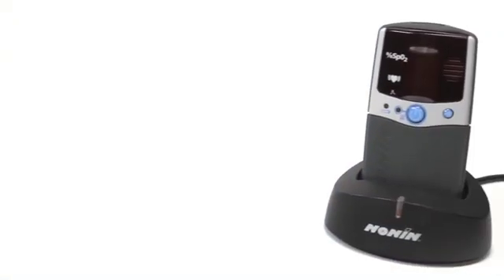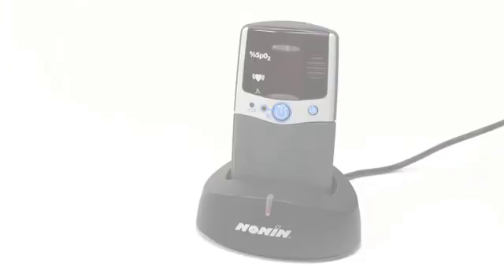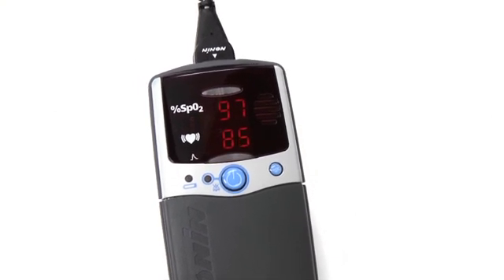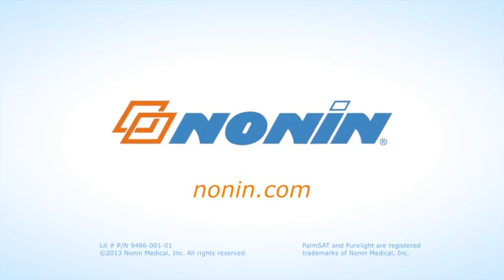With proper use, the Nonin PalmSAT model 2500 or 2500A pulse oximeter will provide consistent, accurate oxygen saturation and pulse rate measurement. You can find additional use information on this and other Nonin products at www.nonin.com.